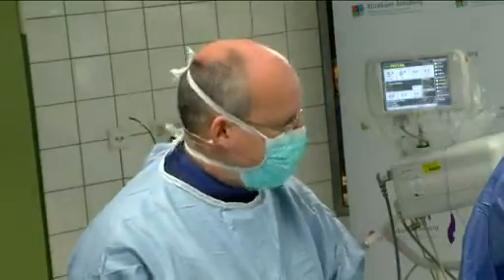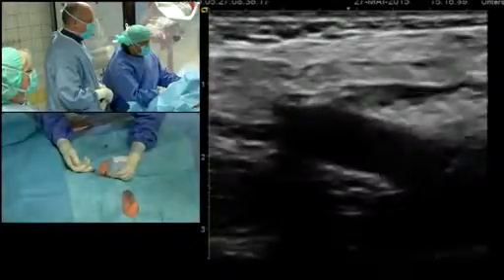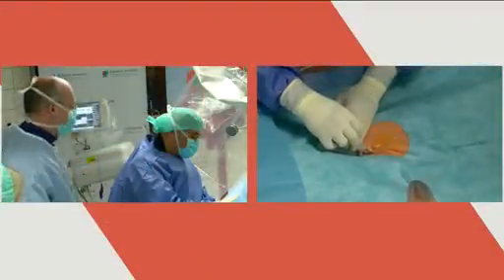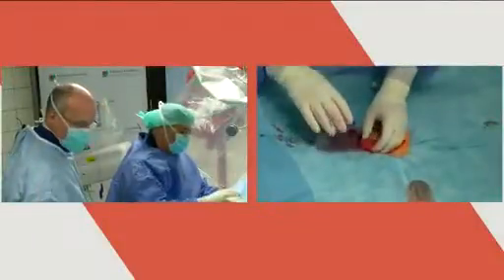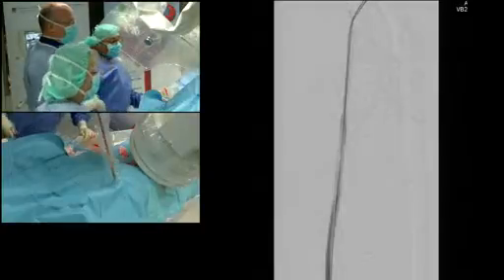We will shortly show you the angio. What we now do in the first step is to find access to the common femoral artery, ultrasound guided, and Marco is showing us how to perform this right now. So this looks quite nice.